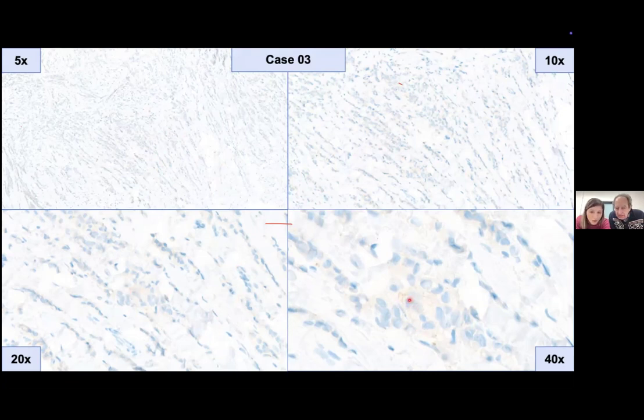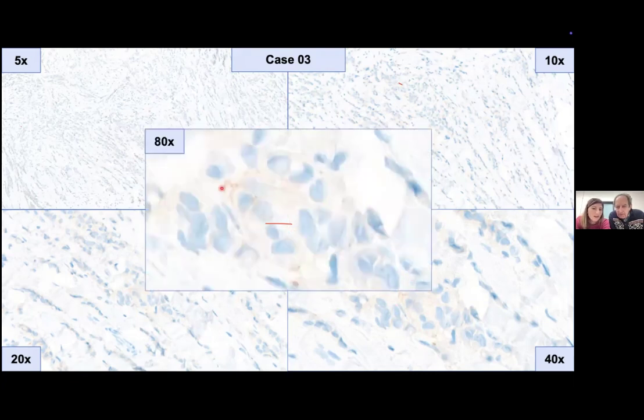Here at the low power, I think there is, to be honest. Okay, so the down arrow. Possibly convincing. So, I would call it ultra low. Now, this would be a case that you need to recognize for ultra low.